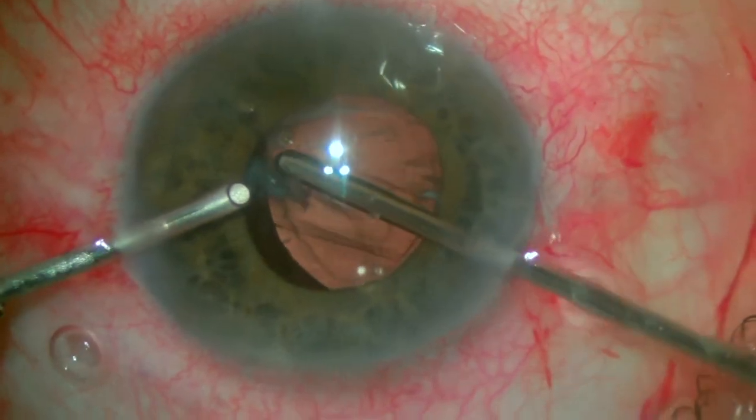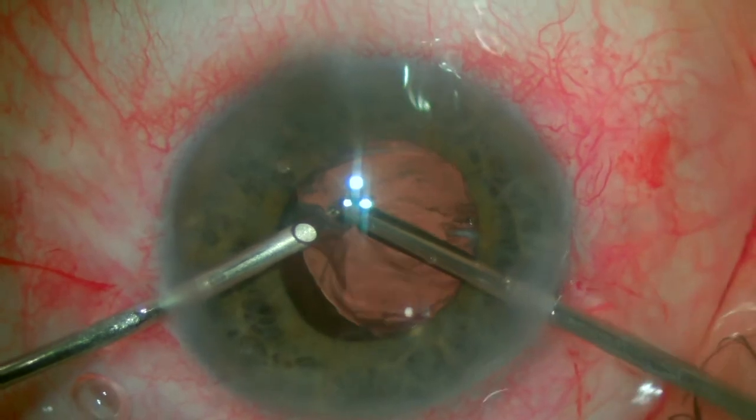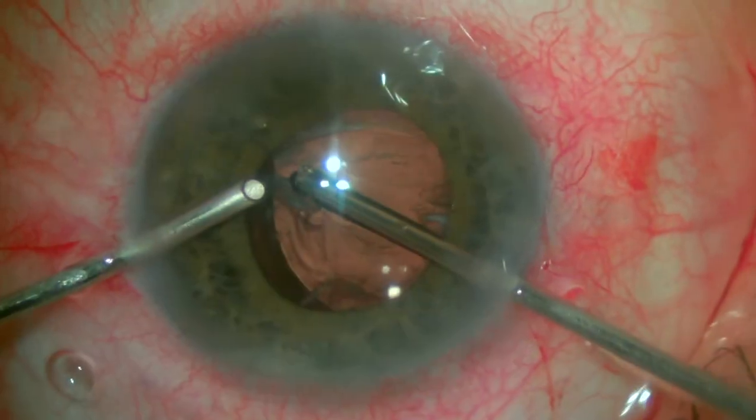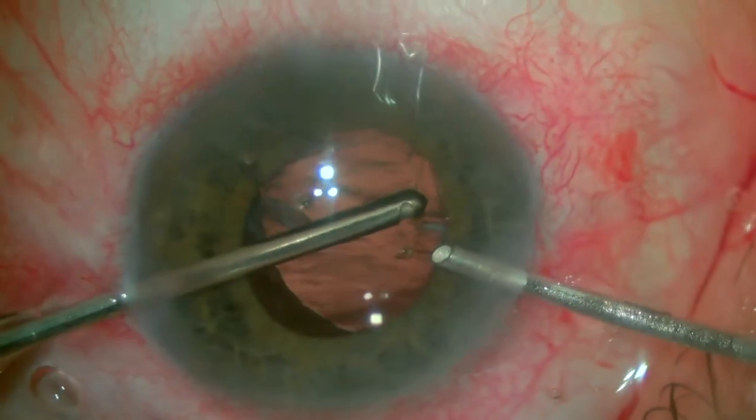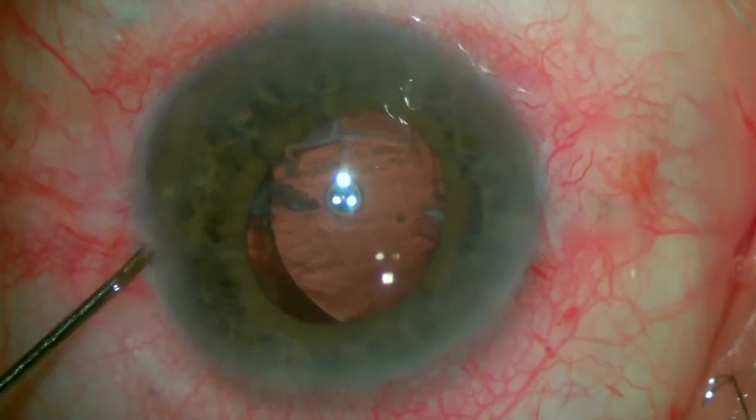Once again, we go back to the bimanual approach. This time, we are able to aspirate more of the lens matter that was cut with the micro-scissors. We can switch hands as needed to reach all the corners of the eye.